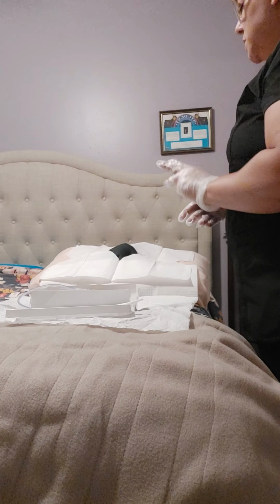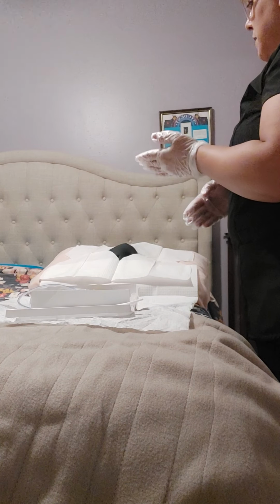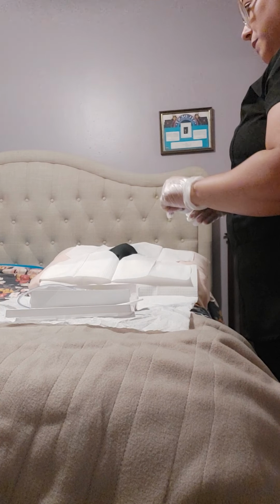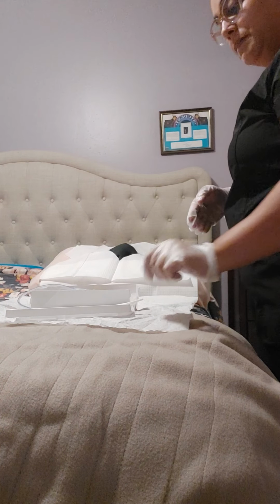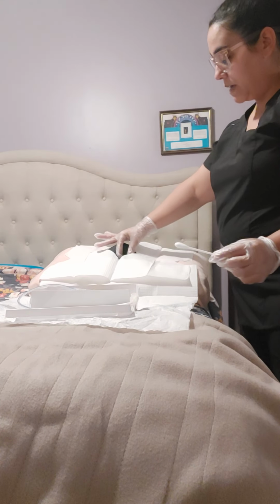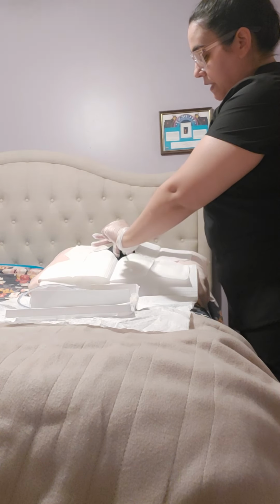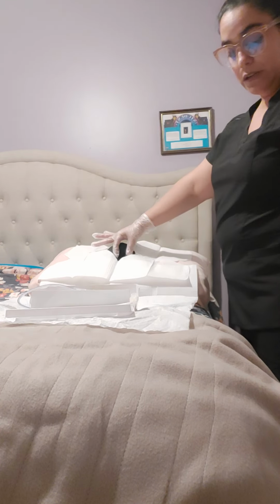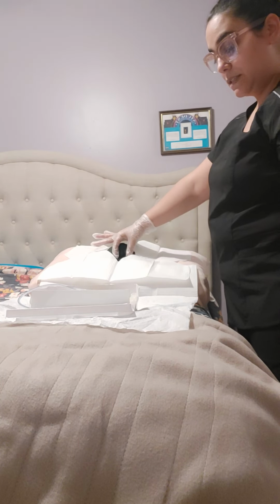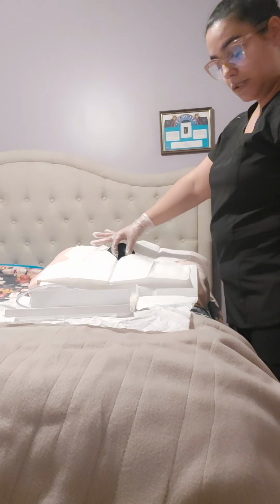So next I'm going to be cleansing the area. I'm gonna do it with 3 swabs. You're first gonna feel it on your outer labia, then on your right outer labia, then on your left side, and then straight down the middle from top to bottom, okay? So I grab the first one, open the area so I expose the meatus, and I'll be cleaning right side first, discard, left side, discard, straight down the middle, discard.